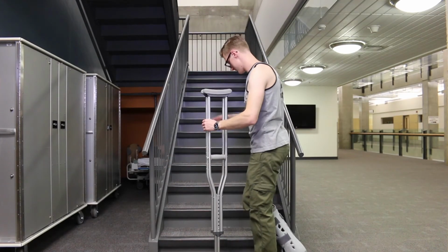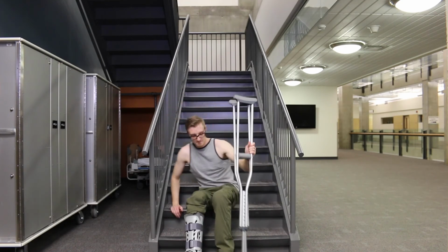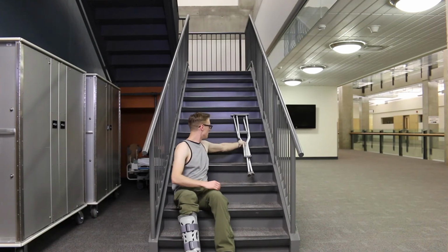You can also place the crutches higher up on the stairs and then sit down and lift yourself up to where the crutches are. Repeat until you're at the top of the stairs.